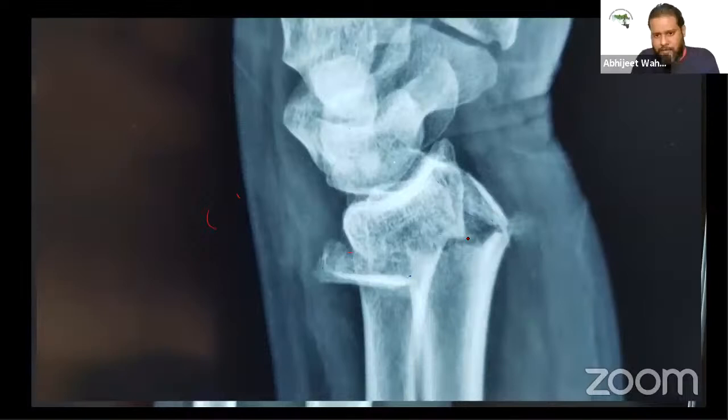So where are we with these views now, ma'am? Styloid is quite displaced. Okay. And probably that will cause some instability. So this is a traction view, madam. Yeah. So in the traction view, most of the fragments are aligning pretty well. But what I see is that obviously the ulnar styloid is still off. There is still some comminution which you can see in the metaphyseal area. The articular alignment looks pretty good. And this is the lateral view just for your reference.